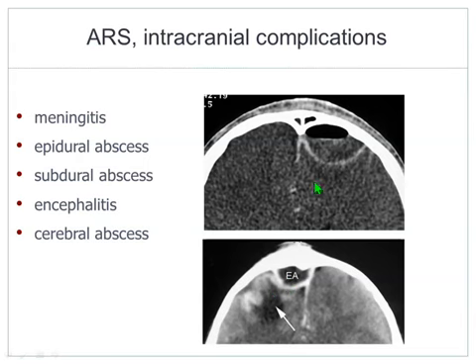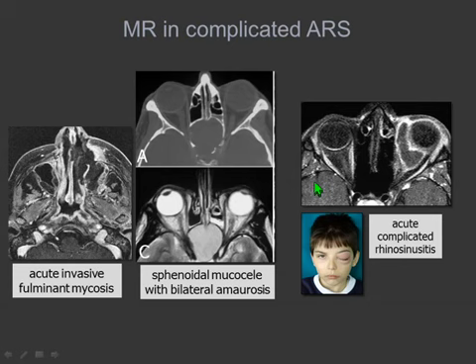Of course, as I already mentioned, in all these cases, imaging is very important, and in any condition, CT should be done with the use of contrast agent. There are also different conditions in particular situations.